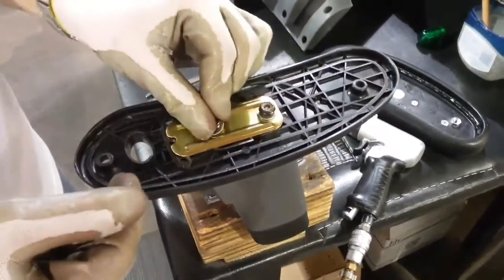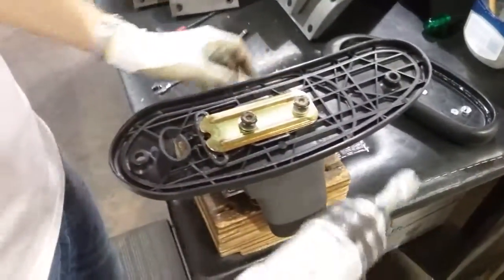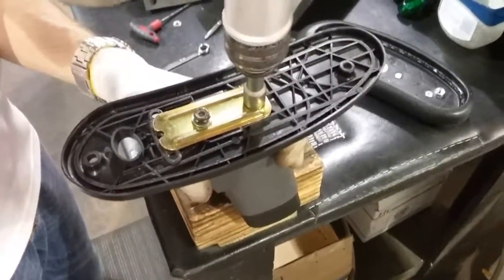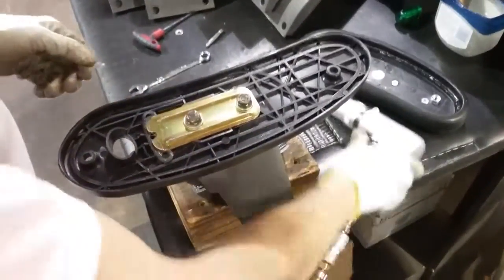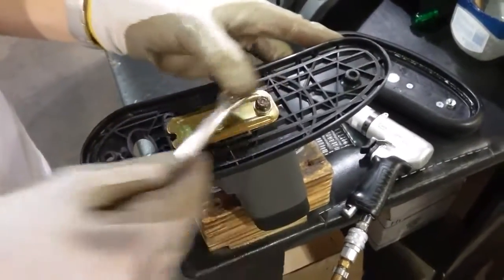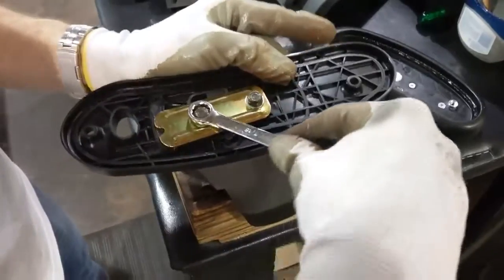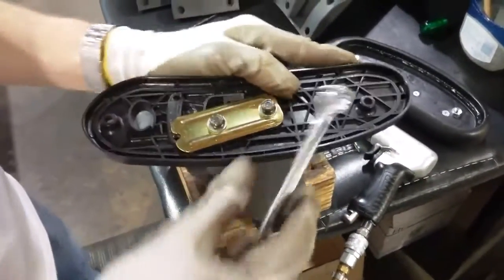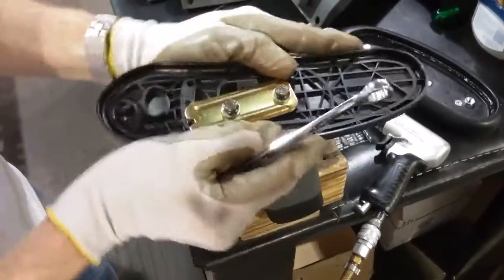Now we're going to show you doing this with a power drill, which you very well may be using. Important thing here to realize. When you use a power drill, it's going to torque these quite tight, and often they're actually on there too tight. So what we're going to see now is you take your wrench, and you're going to want to loosen them slightly. What you're going for here, folks, is you want to have a little movement to this arm pad. And so you can see now they're slightly loosened but still firm, but it allows the arm pad to move to go into that lockable 3-way position. Okay, so there we have it.